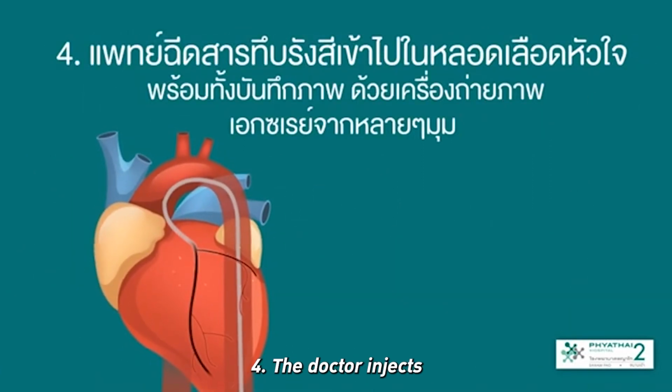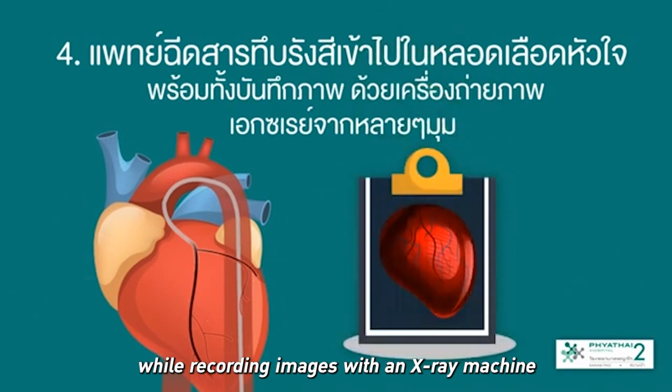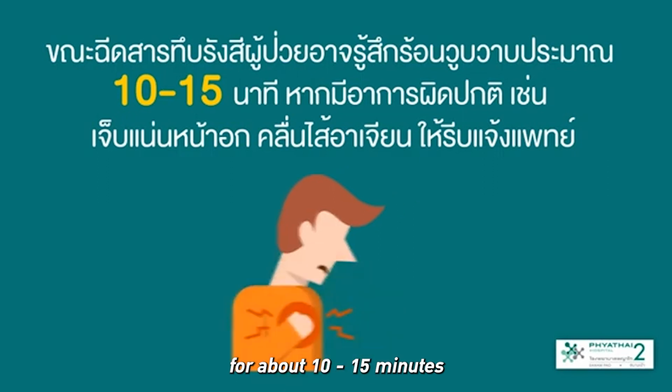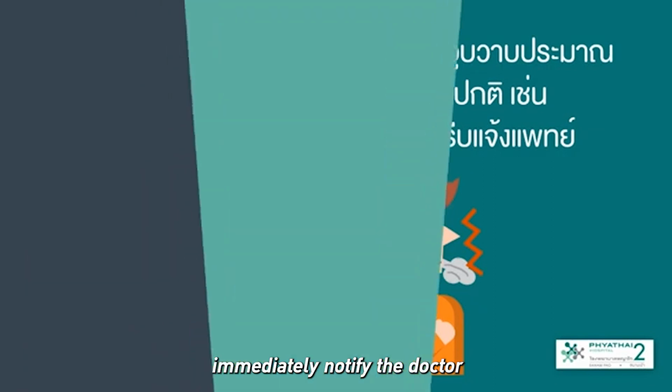4. The doctor injects the radiopaque substance into the coronary artery while recording images with an X-ray machine from multiple angles. Patients may feel a warm flush for about 10 to 15 minutes. If there are any abnormal symptoms, such as chest pain or nausea, immediately notify the doctor.